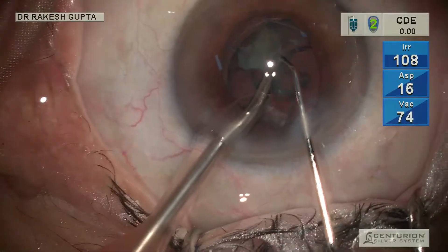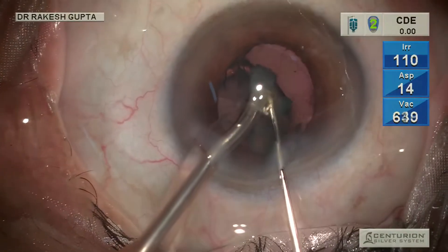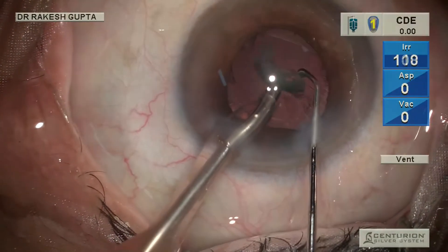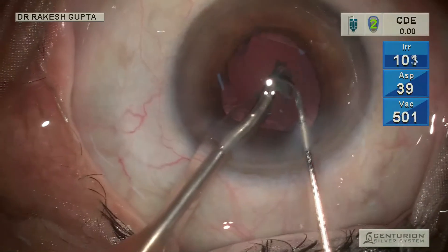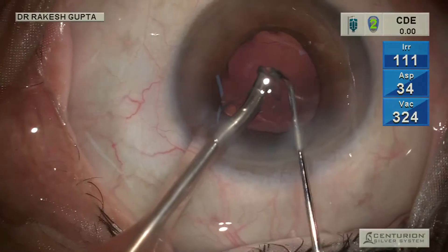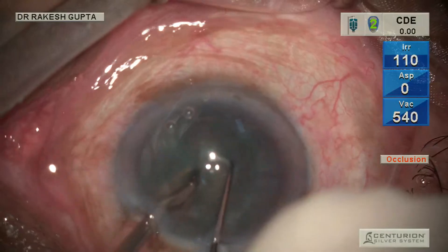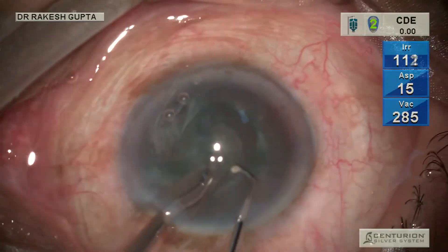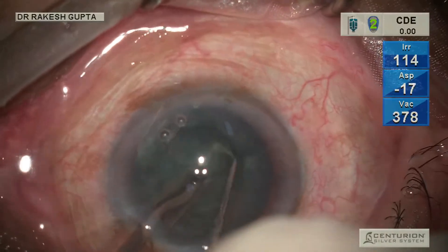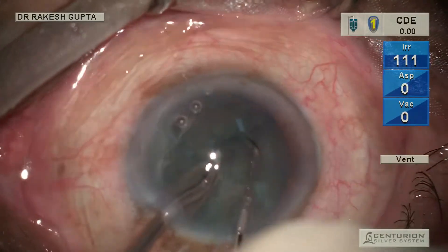This is another case where I am doing zero-power phaco — this is almost grade one to grade two cataract. You can see it is not difficult to hold the nucleus with the phaco probe in vacuum mode, and I am chopping the same way. I am calling this technique vacuum chop with zero-power phacoemulsification. I have increased the speed of the video to cover what I can show in the allotted time.